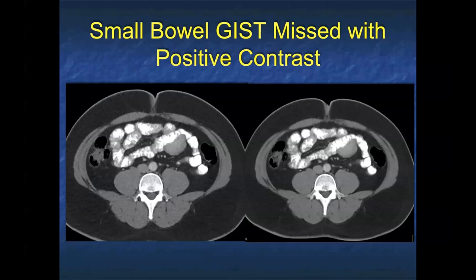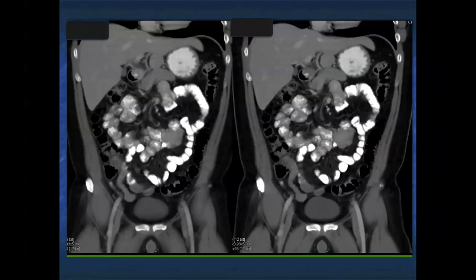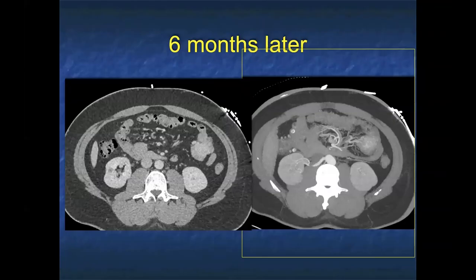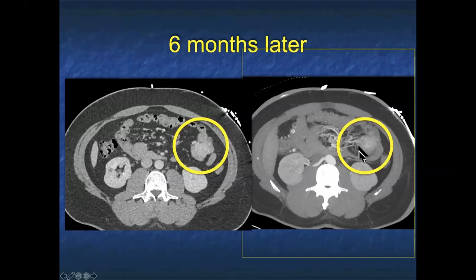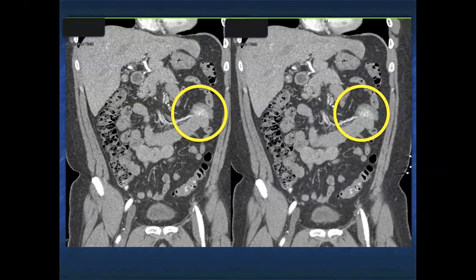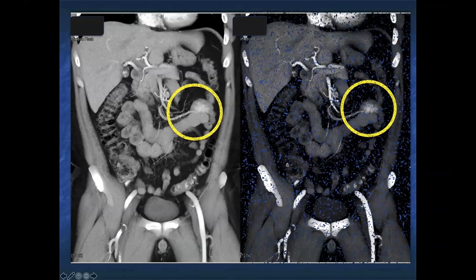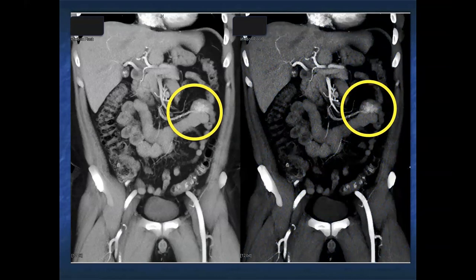Regardless of the protocol, you can still miss things. This was initially read as negative — whoever read it assumed this was unopacified bowel. But when you look at the coronals, you realize all the bowel was opacified with positive contrast, and this is really a mass sitting in the root of the mesentery rising off the bowel. You can see how easy it was to miss. The patient comes back six months later; we used water, no oral contrast. If you look at the MIP, you see the enhancement and feeding vessels into the lesion. On the coronal view, it's much more obvious. Even something like a five centimeter mass, you need to be very careful — it's very easy to overlook small bowel tumors.